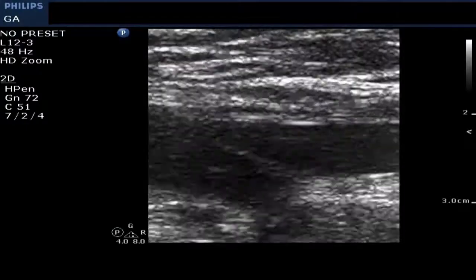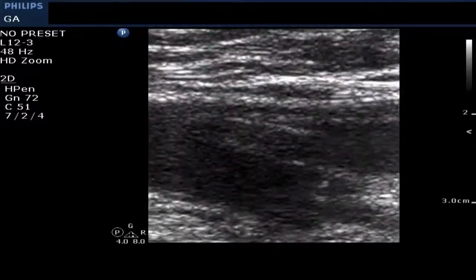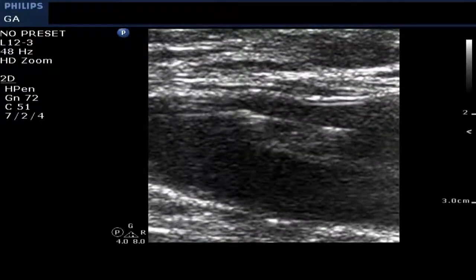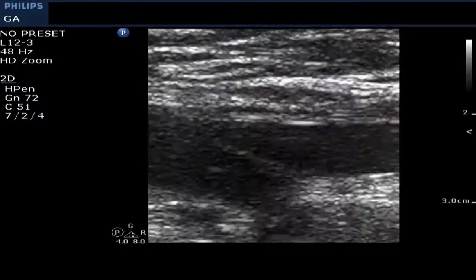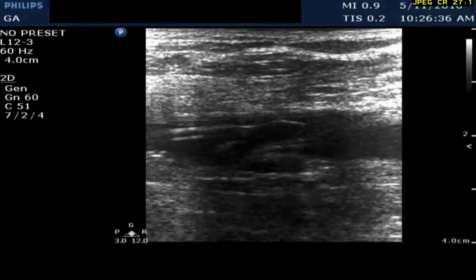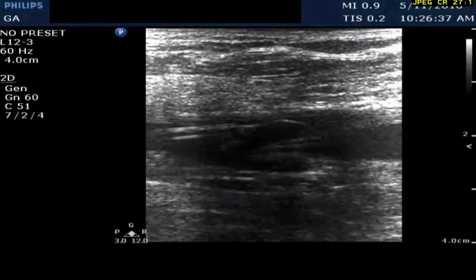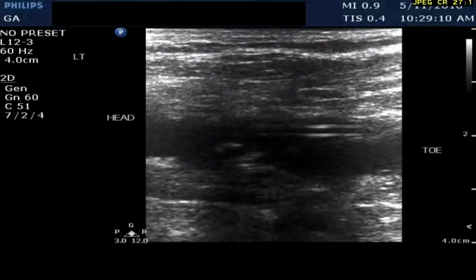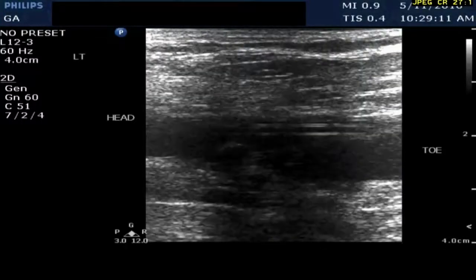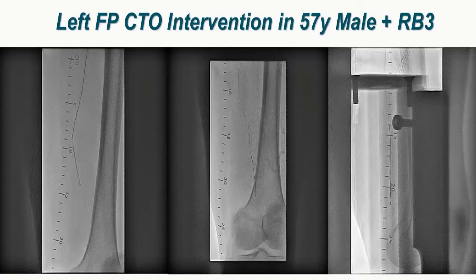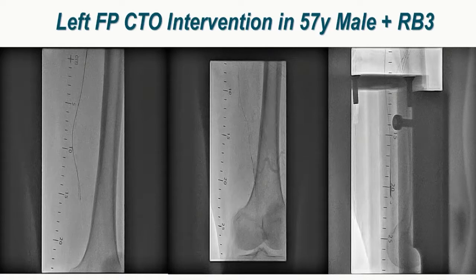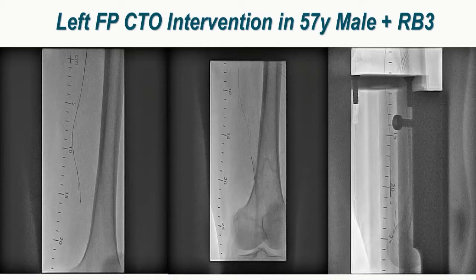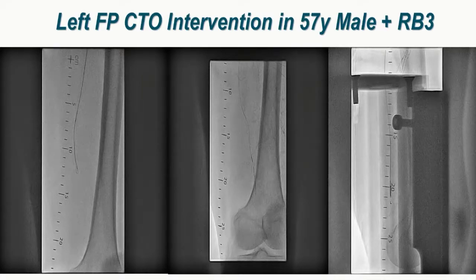A guide wire was advanced across the tip of the catheter — you can clearly see the angled guide wire being advanced. Once the guide wire is advanced, you can wedge the catheter into the osteal SFA and be very comfortable you are in the true lumen. The first guide wire was escalated to an Astato 20-gram wire to penetrate the cap, supported by the catheter. The catheter can then be freely advanced. Starting in the true lumen, even if you deviate into the sub-intimal tract, keeps you very close and we were able to re-enter with an outback catheter to finish the case.